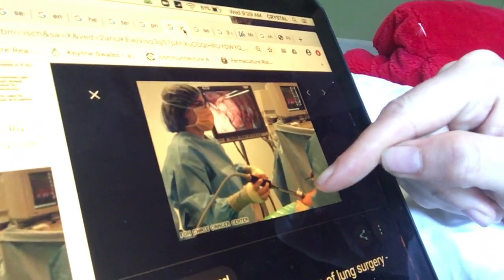When we do surgery, it's very much a chest trauma. You can see they're poking a hole in there and creating trauma, and so then they leave that chest tube in to help the lung stay inflated as the patient heals from surgery. And pleural empyema, which is an infection in the pleural space that has gotten there some way or another and needs to be cleaned out and drained out.